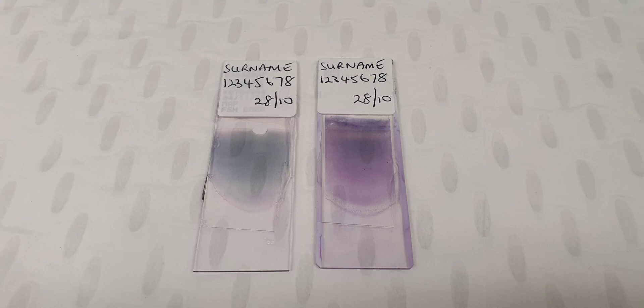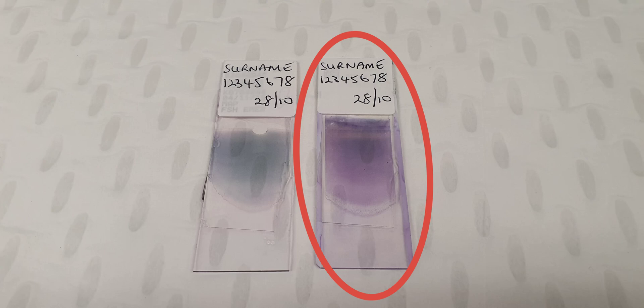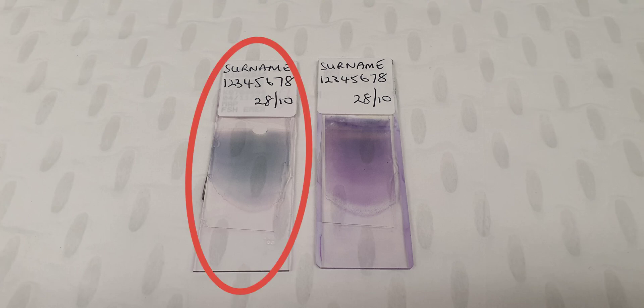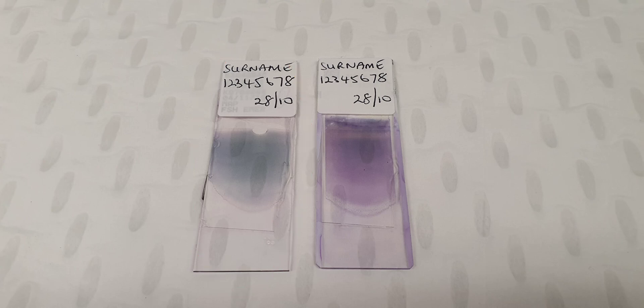Parasites can be seen in a normal Romanovsky stained film, but it's recommended that you use a stain with a higher pH of 7.2, such as Giemza. The Giemza stain will allow detection of the finer features of parasites, such as Maurer's clefts.